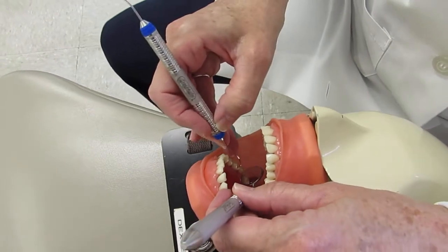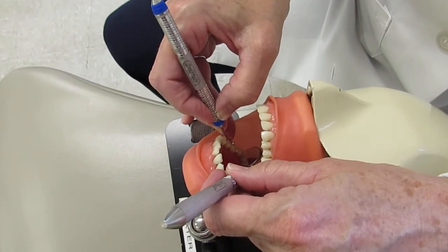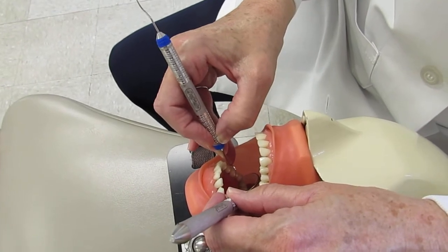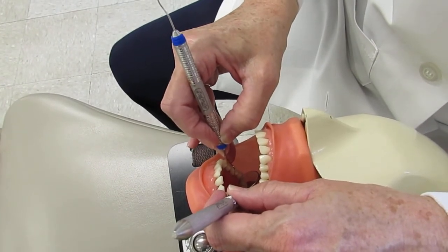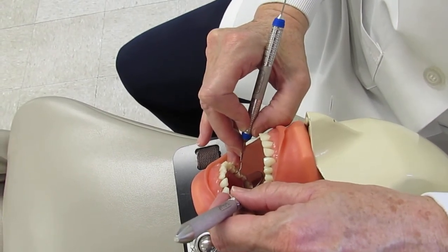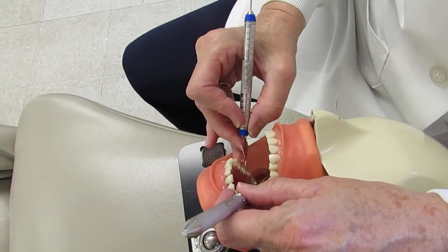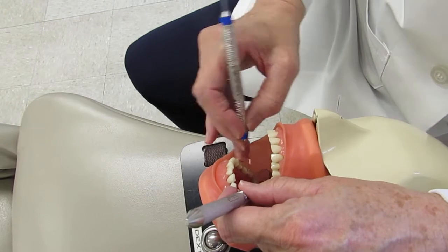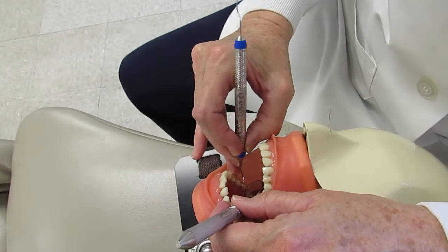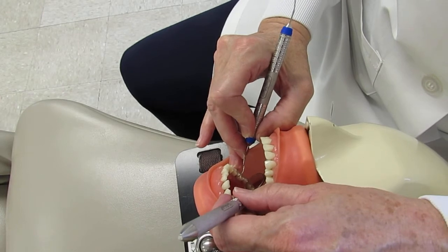Notice the handle position: when inserting on the distal line angle, the handle sits between knuckle two and knuckle three. As you walk across the tooth, move the handle back toward the V of the hand — that's how you get the shank parallel. This requires a light grasp so you can move the handle back and forth. Coming in fairly horizontal, insert, and as you approach the line angle, push the handle back into the V of the hand to get the shank tall.